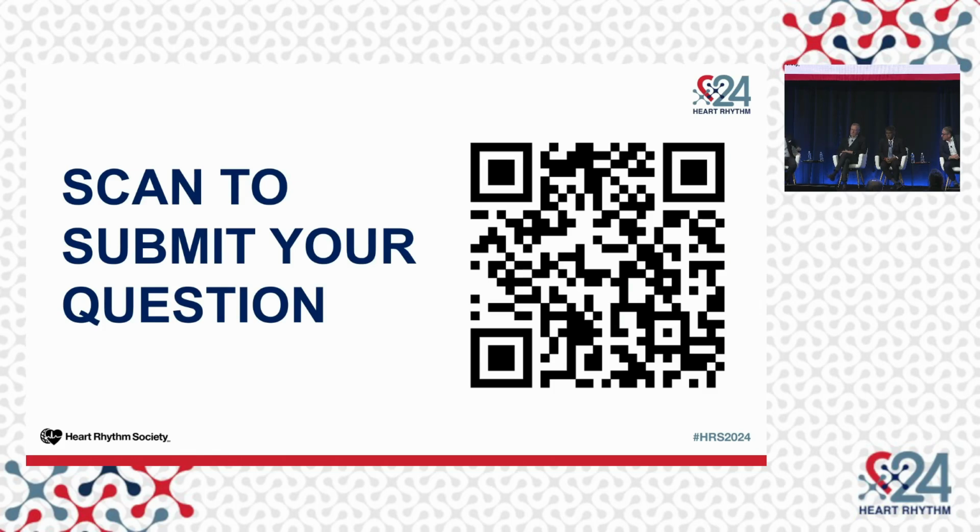And that leads us right up to Jacob's talk. Jacob Koruth from New York is going to talk to us about this concept of a true single shot. When we say single shot, you hear single shot catheters, but you still need to do 12 applications in a vein. So, is that really single shot, or is that more of a regional catheter? Let's talk about the concept of actually putting the catheter in one location and isolating the vein.